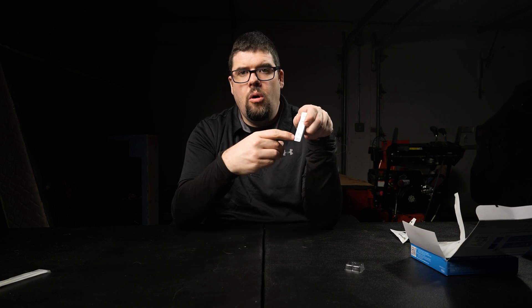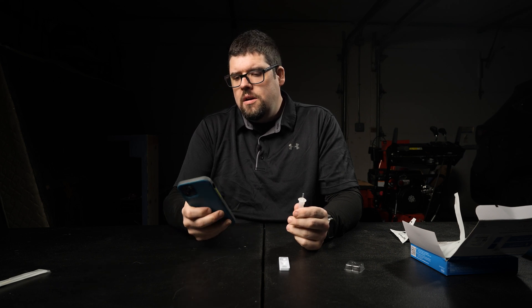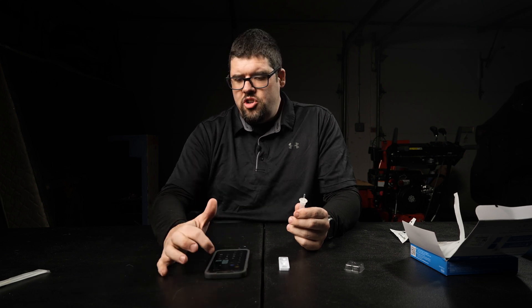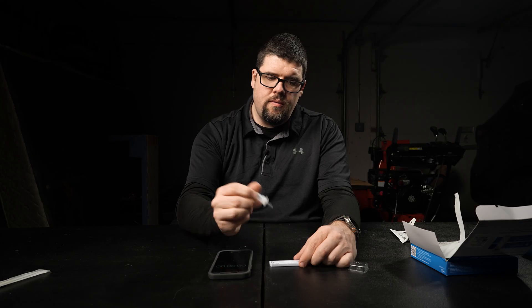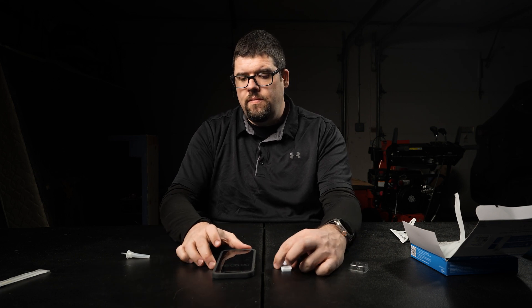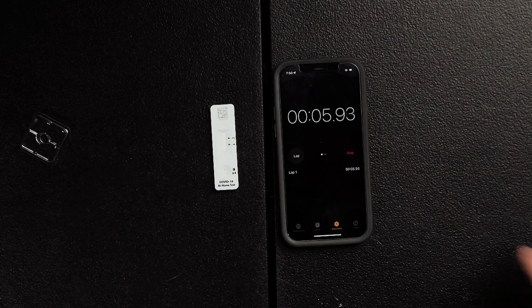Here's the test strip and here's the hole. You're going to put four drops in this hole. I'm also going to put up a timer so we can see exactly how long it takes for my test results to come about. Four drops — one, two, three, four. It comes out really fast. I'm going to hit start and we'll see just how fast this takes.